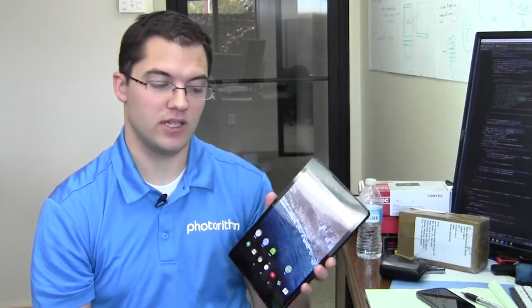Today I'd like to show you an app that we've developed to monitor heart rate using a camera. I have the Nexus 9 tablet that I'll be demonstrating this on. We did write an Android app, so this can run on a variety of hardware. This is the device we have been developing it on.